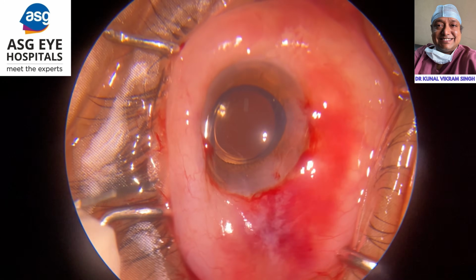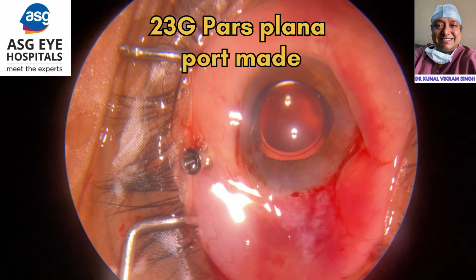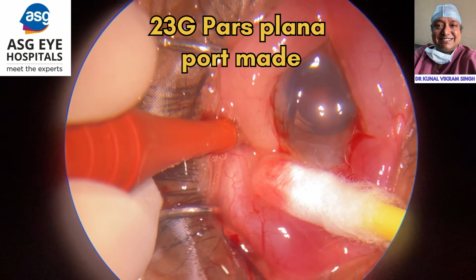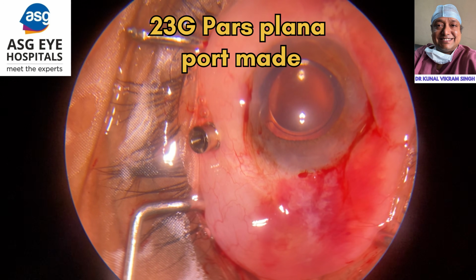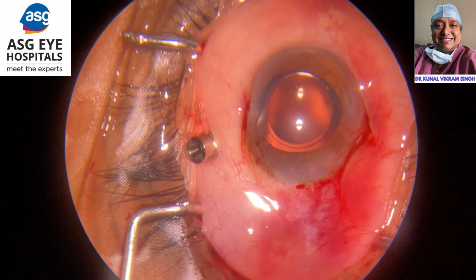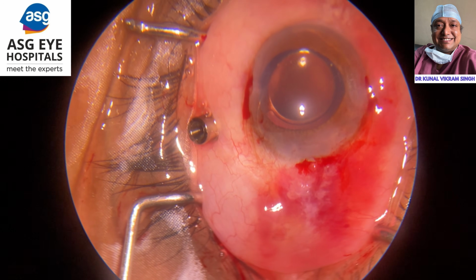Now, if you see, when this 23 gauge port is made superiorly at the 11 o'clock position, you can see a gush of fluid coming out, indicated by the arrow here, and that relieved the aqueous pressure from behind.